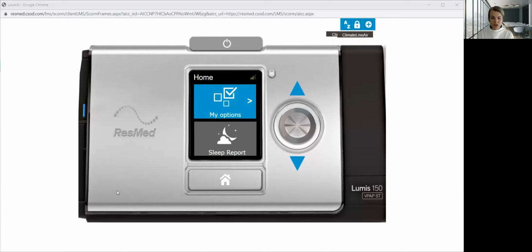Here in this section, I'm going to present to you how to access the clinical menu and how to adjust clinical settings, and also how to evaluate the non-invasive therapy by using monitoring screen.